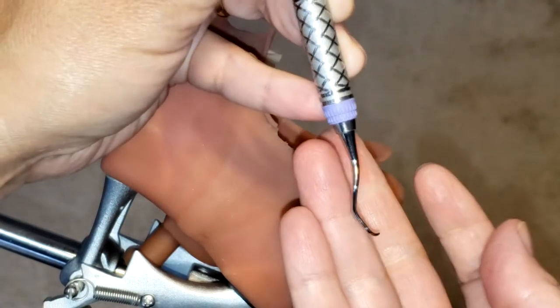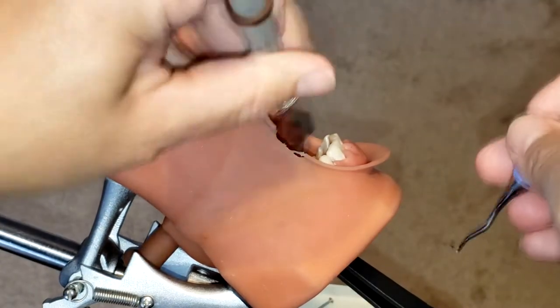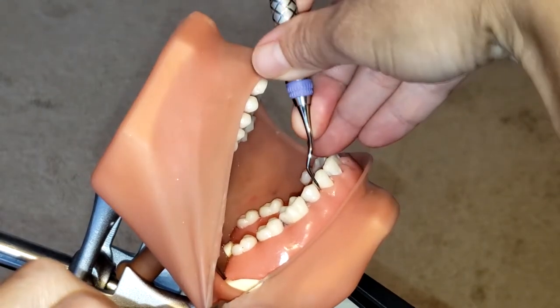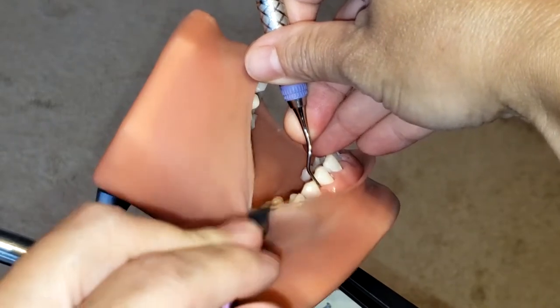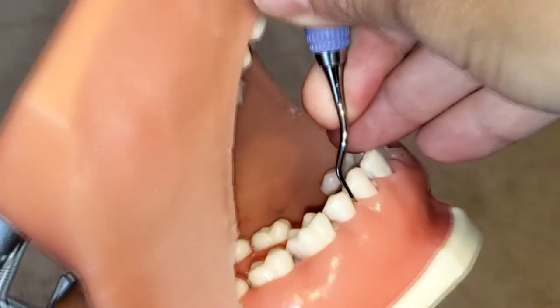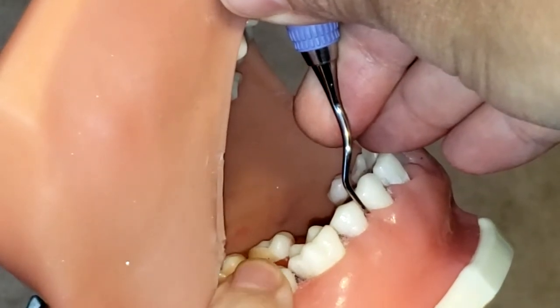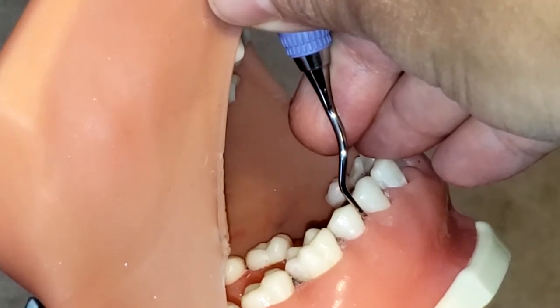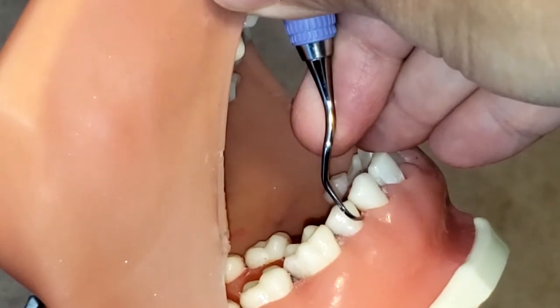This instrument is great for moderate to heavy calculus removal, especially in hard-to-reach areas. Before we begin, we need to establish the correct working end. One way to do that is to place the instrument straight in between the two premolars. You can see how the lower shank is parallel to the long axis of the tooth, and it creates a bend that looks like a V pointing towards the distal aspect of that first premolar.